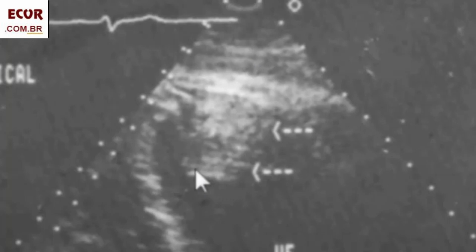Second, because this edge of the possible thrombus is not situated at this location, as this wall, for instance, this edge is being made right in here, close to the transducer, and the image it produces is here, away from the transducer. If this were a structure at the same depth as this wall here, if we angle the transducer to one or other side, this wall would also change its position accordingly.